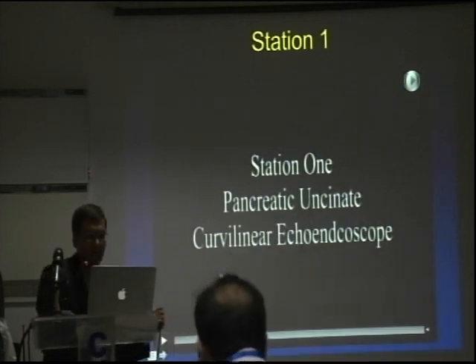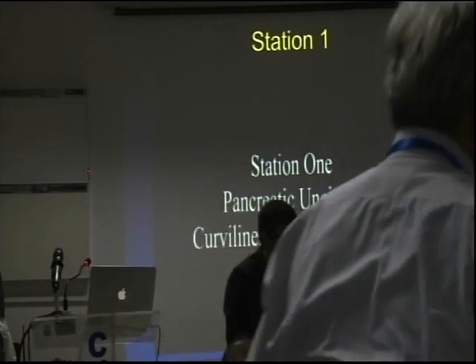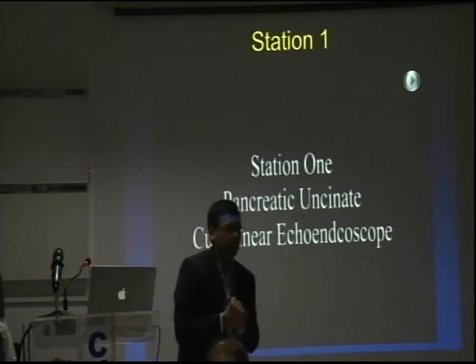So for teaching purposes, you suggest that in order to get to station 1, do you think fluoroscopically it would be better for the trainees to understand that they are in station 1, or just use the landmark of the papilla?